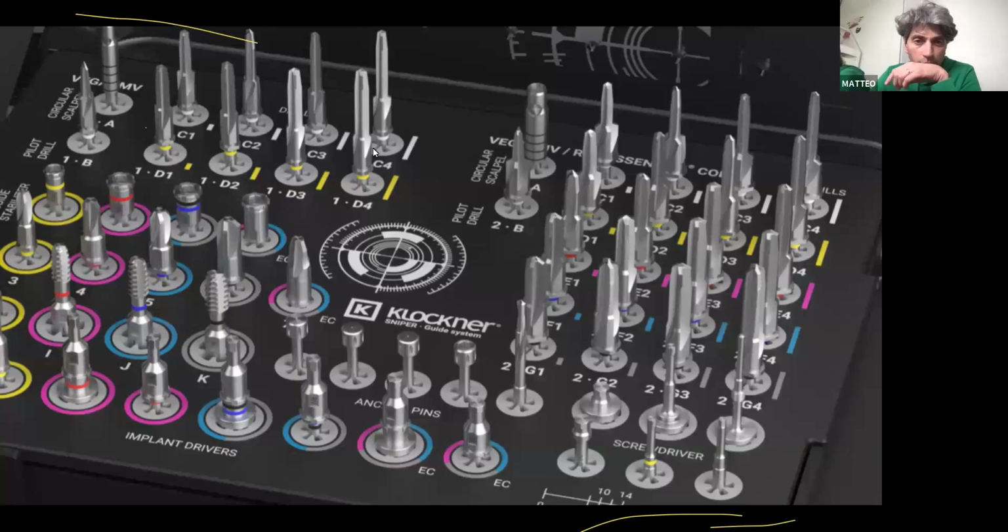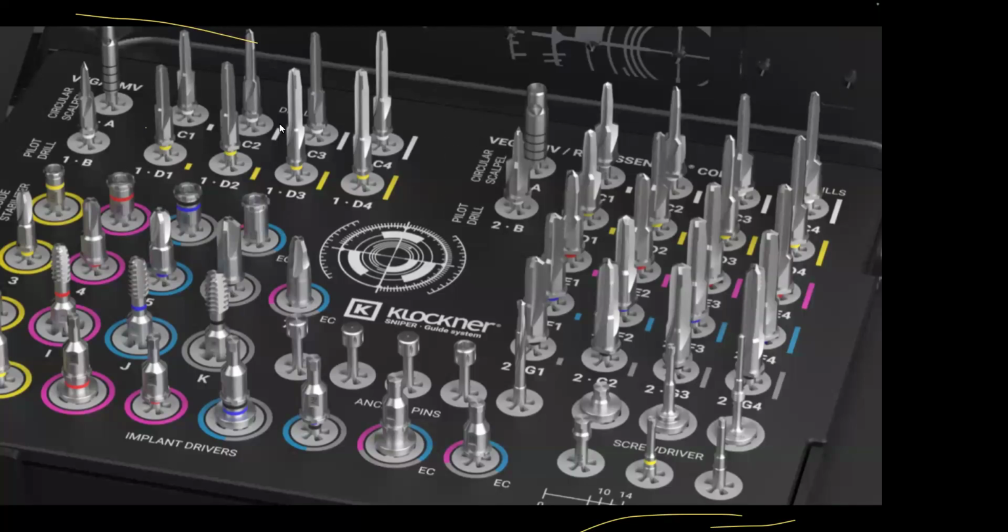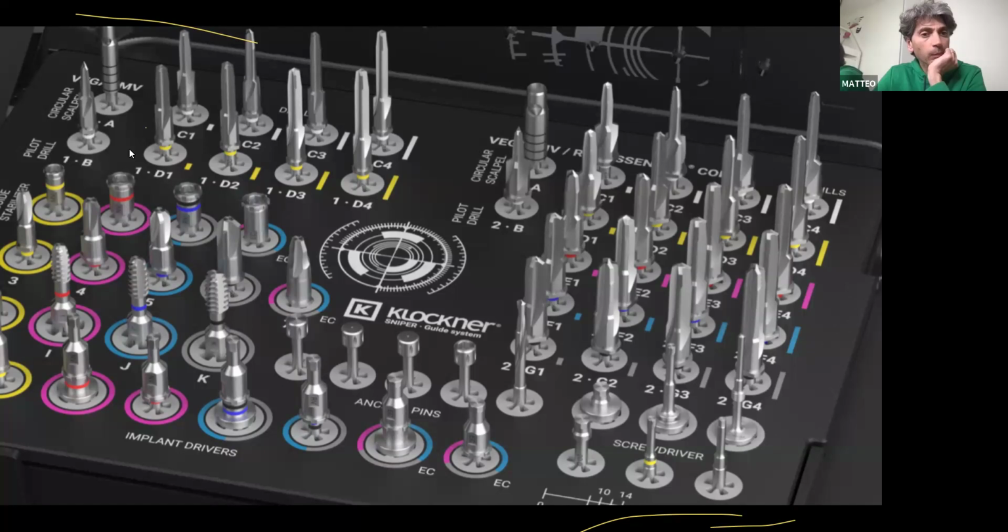A question: can you see the arrow? Yes. Okay. So this yellow part is only for 3.1 implants, VEGA and VEGA Plus.